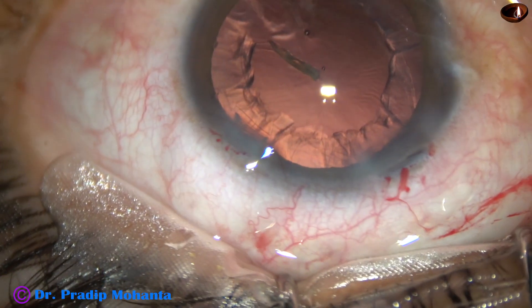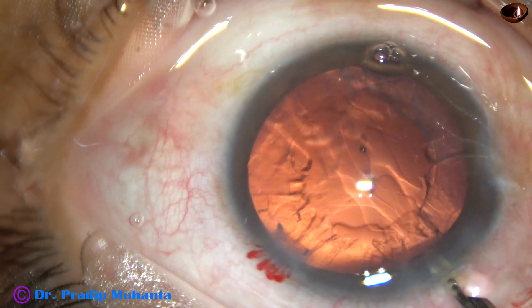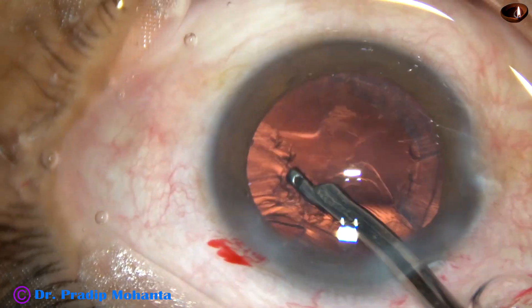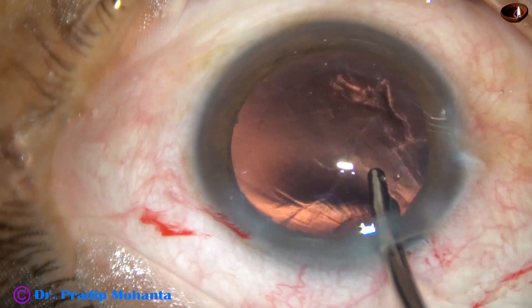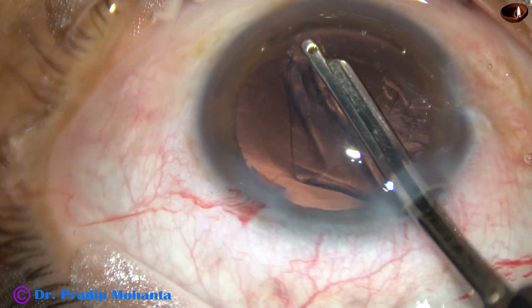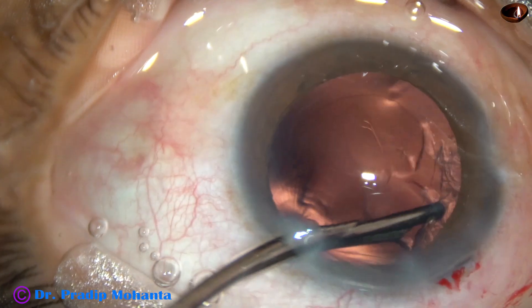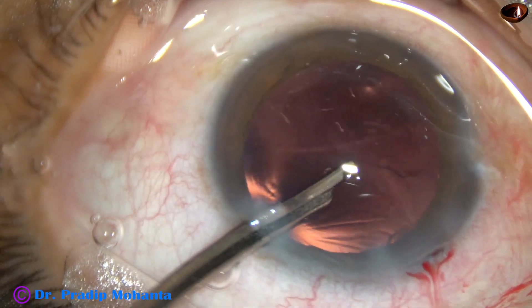In this case I have made only one side port, so I am going to use a 23G Simcoe cannula — a very thin, slender Simcoe cannula. See how efficiently we can remove the cortex with this instrument. We can also use a coaxial irrigation-aspiration device, but the coaxial is thicker and doesn't go through the side port, whereas this goes through a small side port.